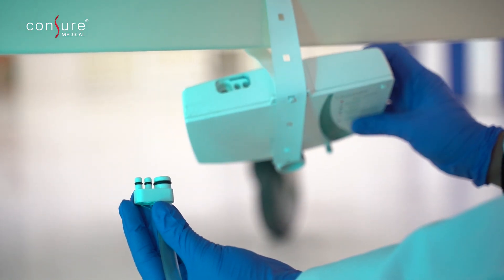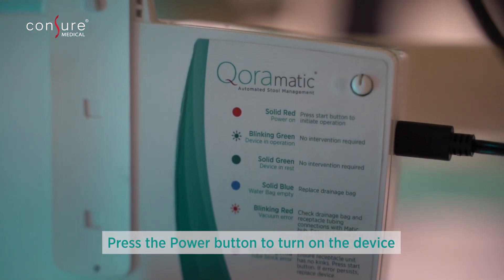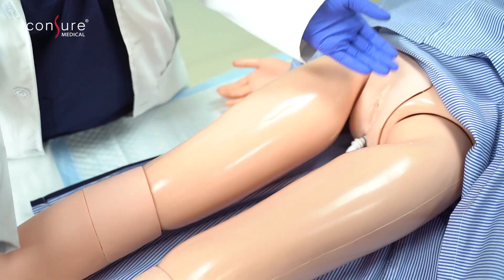Connect the distal end of the transit tube to the Matic Hub and push down to ensure it is secured adequately. Press the power button to turn on the device. The green LED indicator will start blinking. After ensuring the device is adequately placed and connected, return the patient to their natural position.